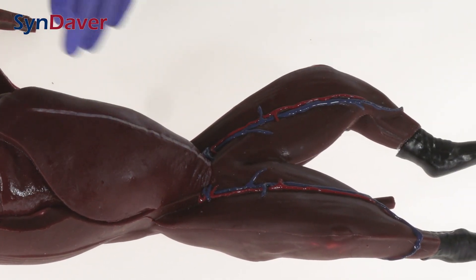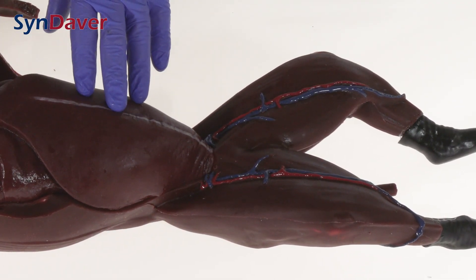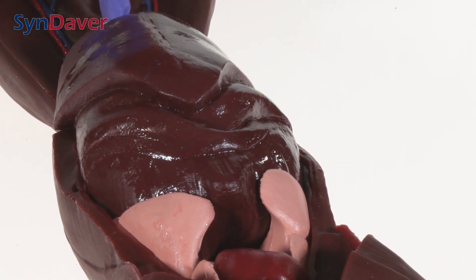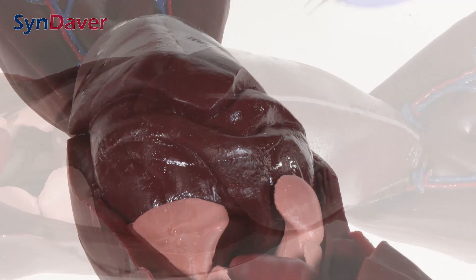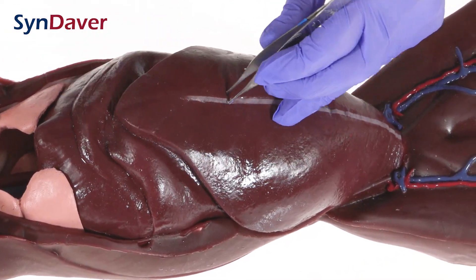The rectum and other caudal aspects are also represented. The diaphragm and abdominal cavity is one piece which contains all the organs, so we'll go ahead and dissect that now. I'm cutting along the linea alba to expose the abdominal organs within.